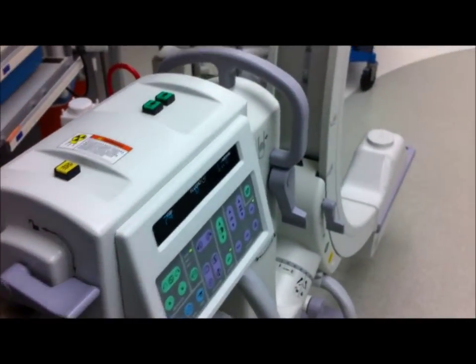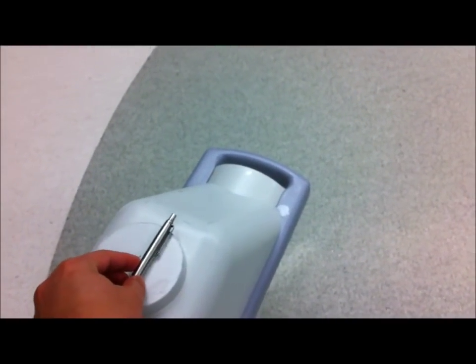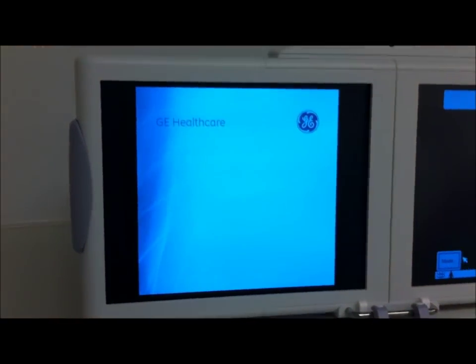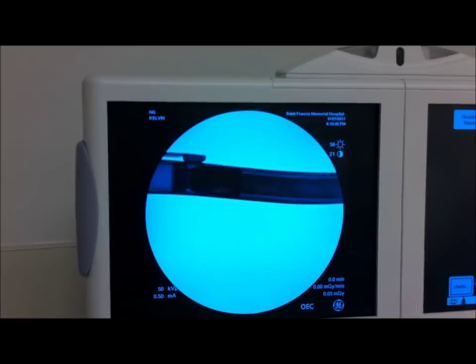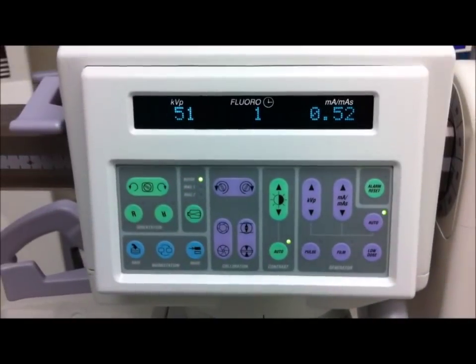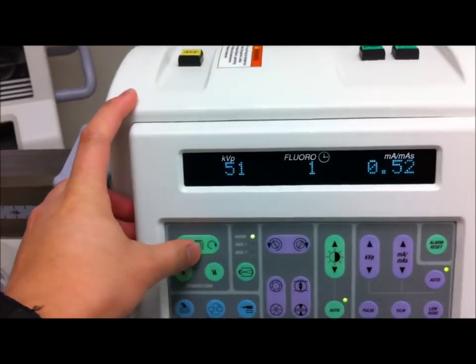Now we're ready to shoot something. Let me just take a look at our C-arm — I'm going to put this right on the tube end, my little pen there. I'm going to step back — I have my lead on. Let's fluoro. Well, that's my pen. Now as you can see, this is not the orientation that I want. So in order to change that, you come right up to this control panel on the C-arm itself. This allows you to rotate the image either counter-clockwise or clockwise.